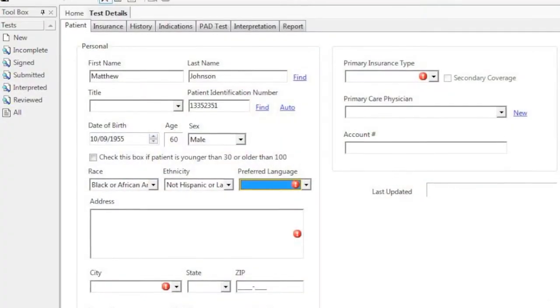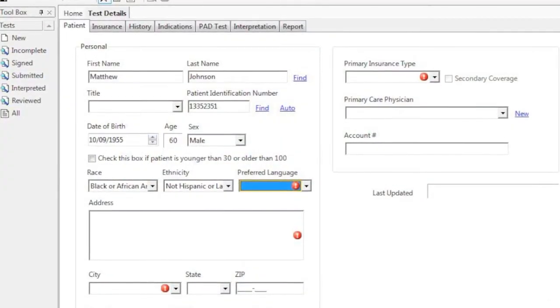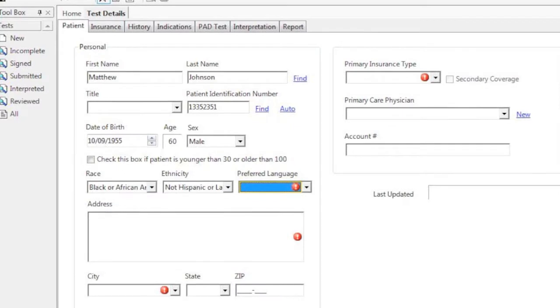When a PADnet exam is scheduled, it is important to let the patient know that smoking is not permitted 30 minutes prior to the appointment. Because pressure cuffs need to be applied directly to their limbs, the patient should also be informed to bring their own clothing that is suitable for the test, such as a t-shirt and shorts that are not constricting. When the appointment has been confirmed, you may wish to enter any available demographic information ahead of time.